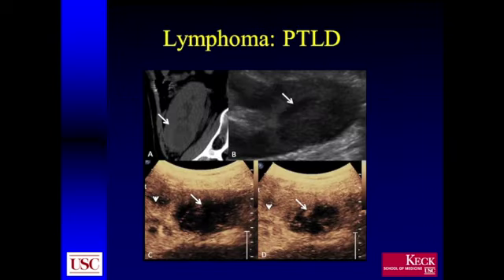Now, I mentioned lymphoma. Lymphoma can rarely affect the kidney. It may occur as an intrarenal mass. Probably in my experience, I've seen it as a shell-like perinephric mass or even perinephric adenopathy. This was an interesting patient in whom there had been a heart transplant and presented with this lower pole renal mass and some renal failure. Here you can actually see, here's this mass.